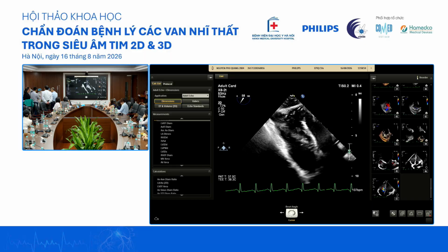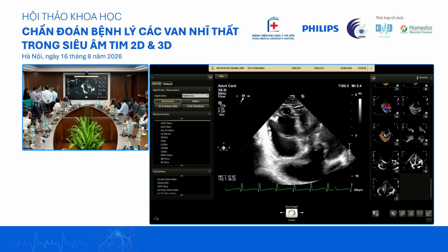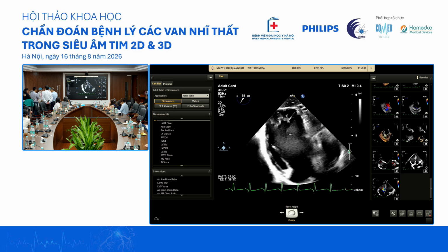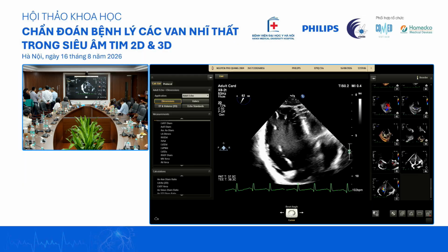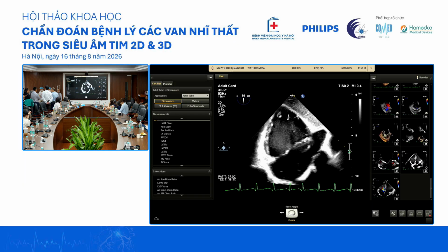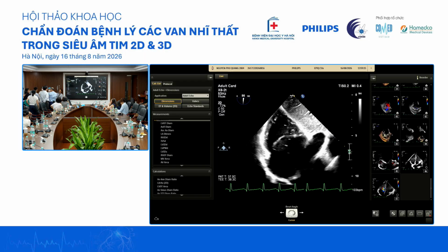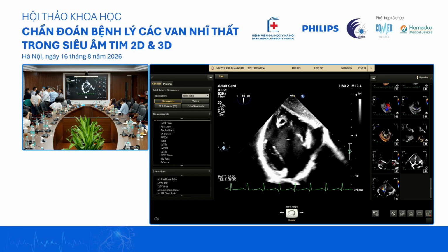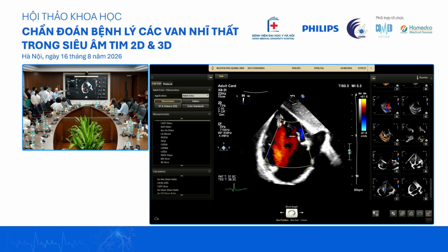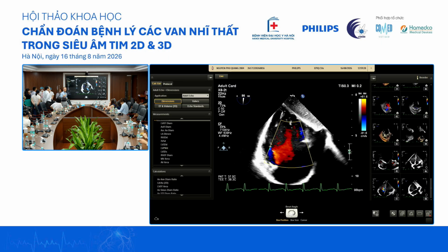Probably have to go in a little bit. Yeah, it's a bit uncomfortable. Yeah, might have to go just a bit more. Just a bit more, and bring the angle up to 80. Okay, and then push in a bit more. Yeah, septal is fine. The free wall, although it's moving, the patient may be uncomfortable. Yeah, it's fine. So the septal leaflet is not short. So again, it's RV remodeling, tugging onto the leaflet.